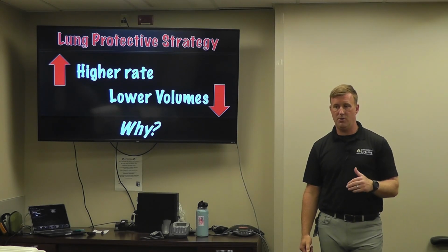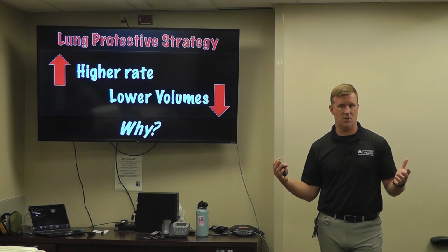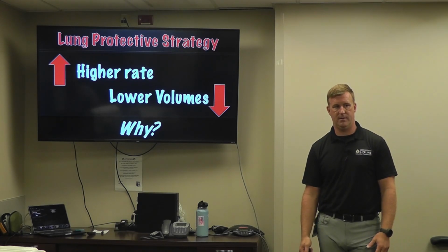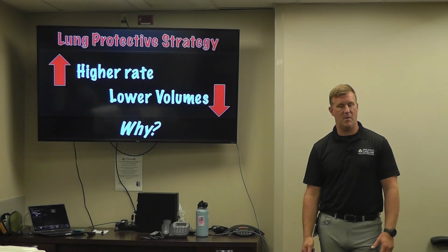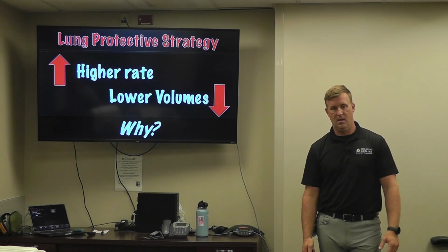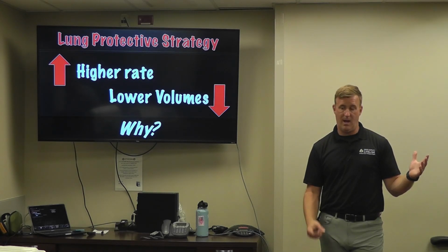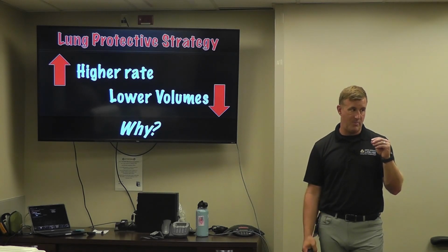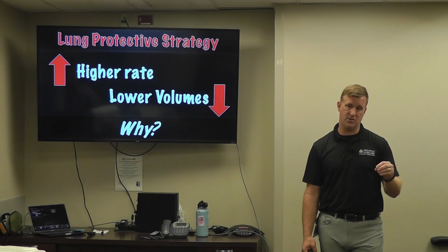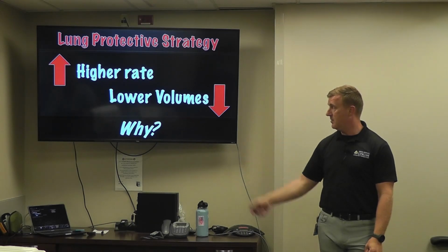But if I drop your volume and I don't bring your rate up, what vital sign is going to get out of whack? What happens when you don't breathe enough? Carbon dioxide, right? Your end tidal CO2 goes up, right? So if I lower your volume, you take little tiny guppy breaths. Let's say you take 40 little tiny guppy breaths, still not as good as 10 full-size breaths, right? Because we got to clear that CO2. So we have to go with that higher rate.